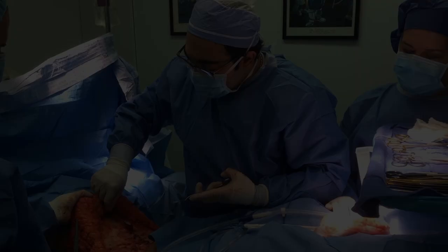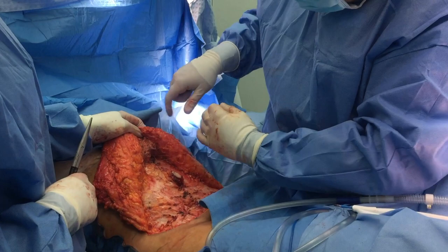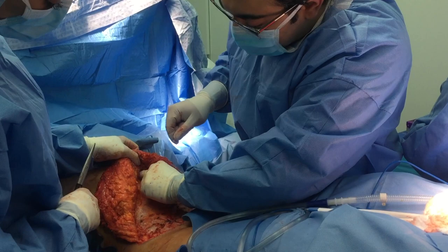Here we are in the operating room. We've already raised our flap and split it down the midline. My assistant is showing me the beginning of the superior part of the flap, which now has our two 2-0s. She advances it while I place my suture down so there's no tension on it, and I've taken basically big bites of Scarpa's fascia centrally in the midline over the plication.